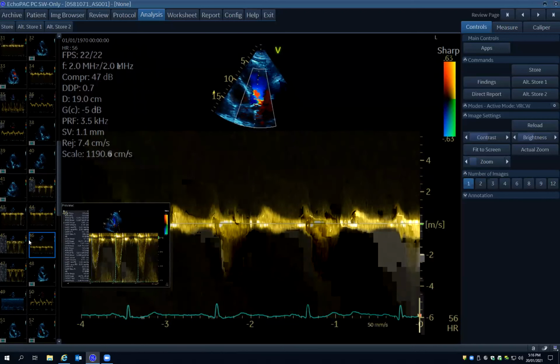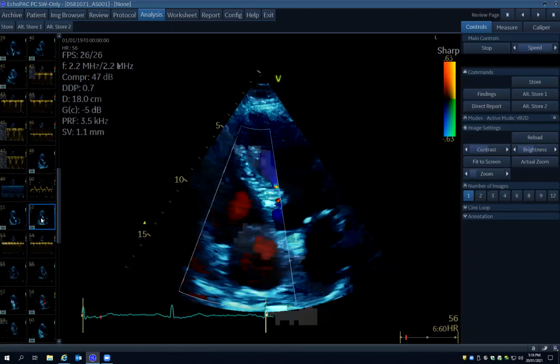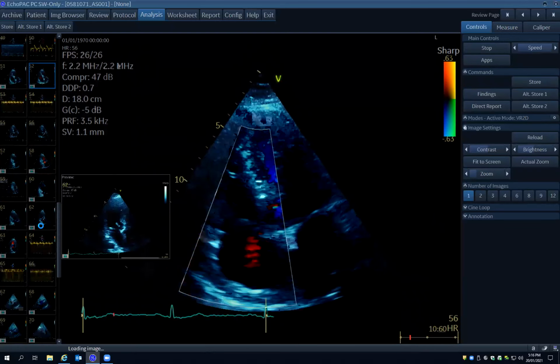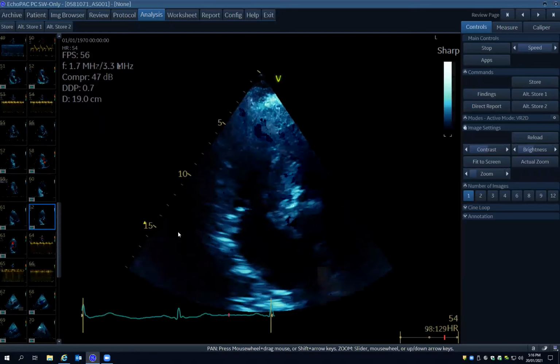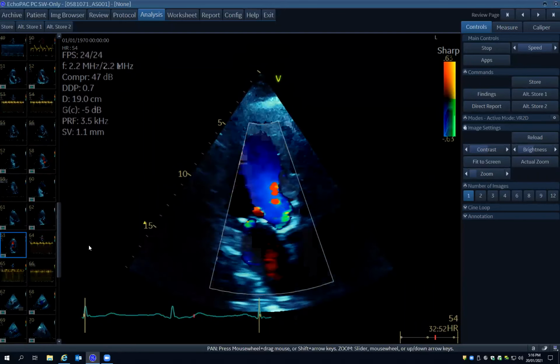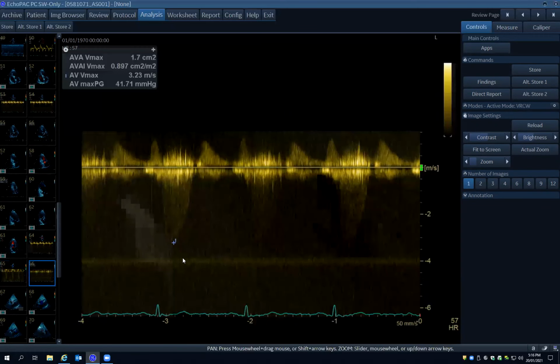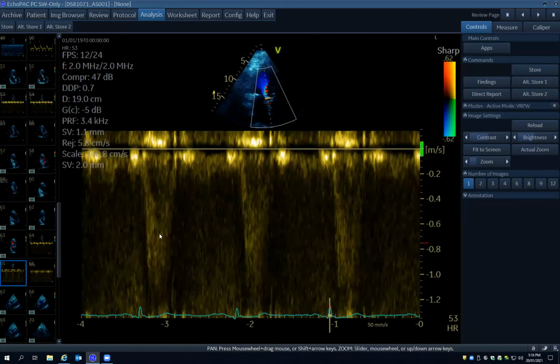First of all, we've just done it in the apical 5 chamber. As you said, they've done exactly what they should, and they've gone on to have a look at it in the apical 3 chamber, which looked like it was quite challenging. But here we can see an apical 3 chamber, again, the sclerotic valve, decent Doppler angles. I think we could have talked about having maybe a little bit more of an optimized color jet. They're not getting great views when they're looking down. They're starting off with pulse wave, I think, here, and they didn't even try the continuous wave.